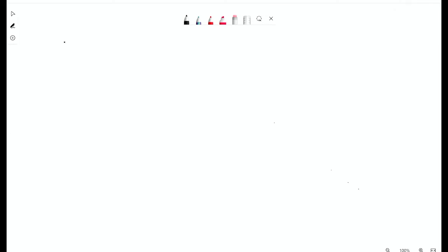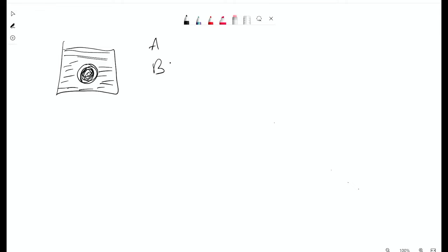So this is the twist sequence, or the modified keyhole. On our first one, our mask or pre, we still fill 100% of the outer portion of K-space and 100% of the middle of K-space. Inside your sequence, it'll tell you A versus B. A is the center of K-space, B is the periphery.